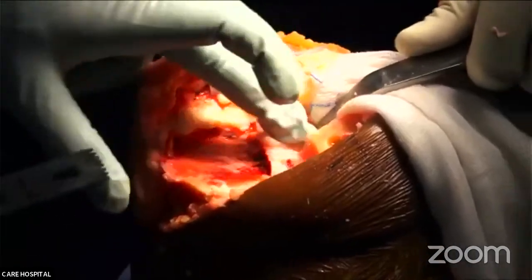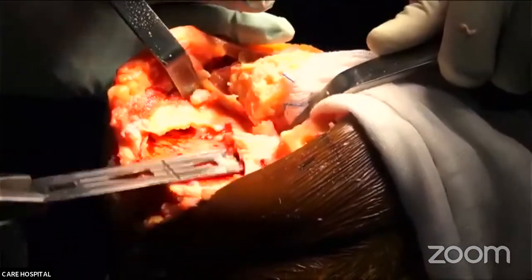So that's what I wanted to show, that this much of bone is left behind posteriorly.